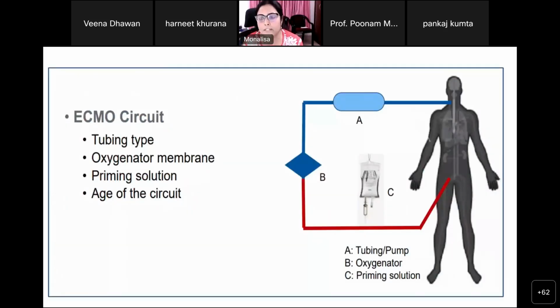Now, the extracorporeal circuit mainly consists of the cannula, the PVC tubing, the polyvinyl chloride tubing, a centrifugal pump, and an artificial membrane for gas exchange, right? So the membrane oxygenator and the PVC tubing comprise a large surface area, which creates a big potential for drug sequestration, which may lead to a lot of drug loss over time, especially the lipophilic drugs.